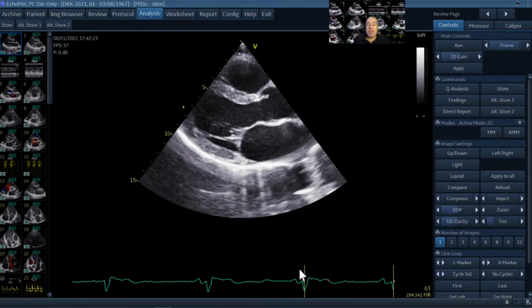Some say end systole is the end of the T wave. Now this is generally usually true, but end systole cannot be reliably identified by the T-wave or by any ECG criterion. The best way to identify end systole is again to look at the valves.